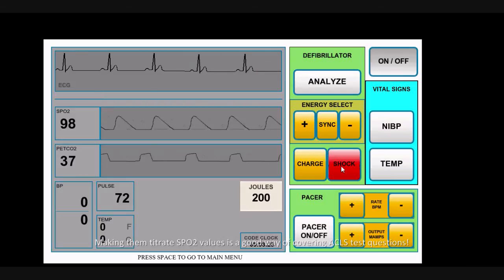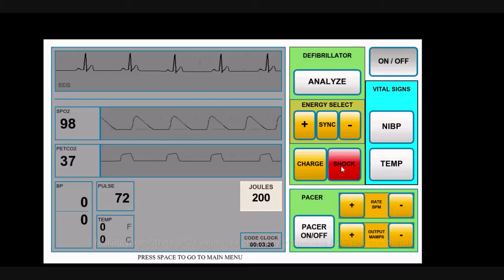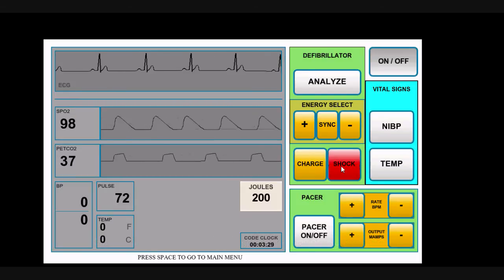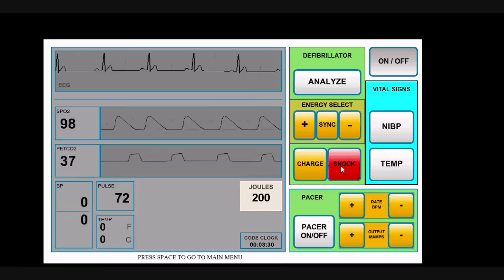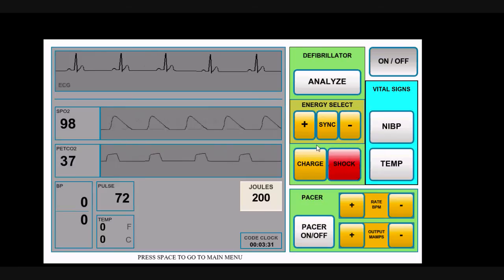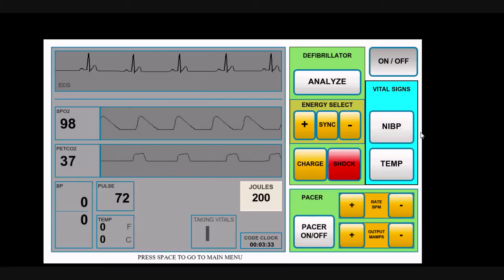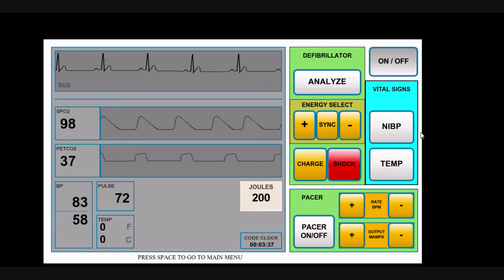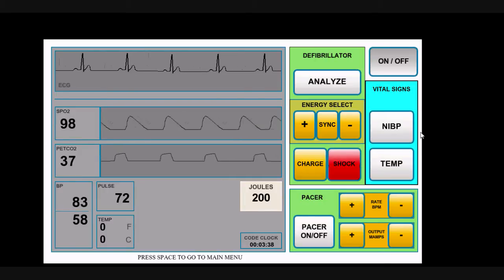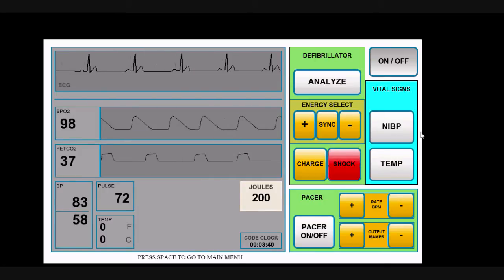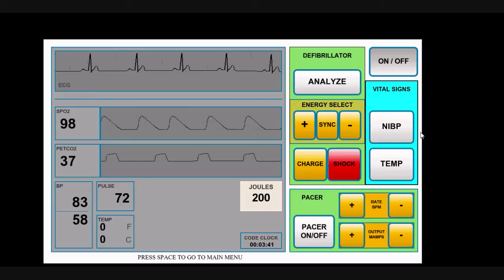You can also program a blood pressure. Let's say that I hit R on the keyboard to program a blood pressure. The student will have to hit NIBP. Blood pressure is not a real-time vital sign. They have to take it on the spot and get a snapshot. Here's a relatively hypotensive patient for an adult.